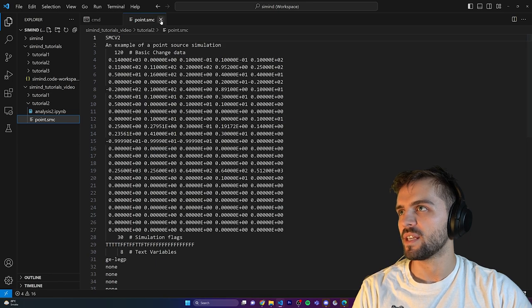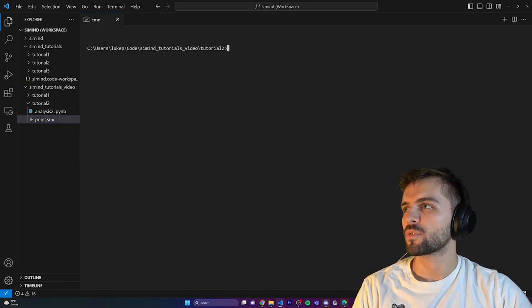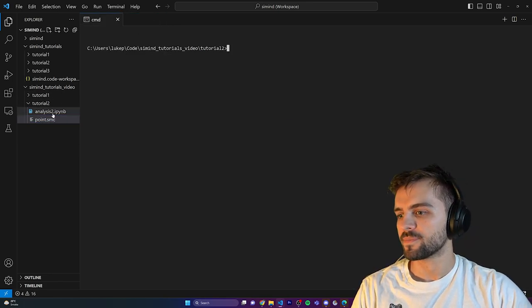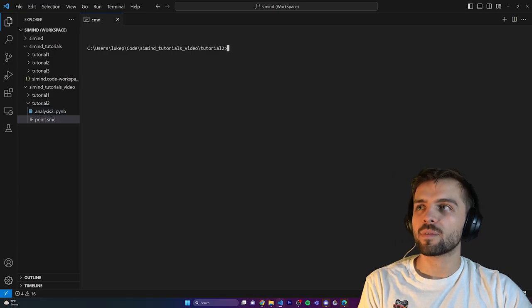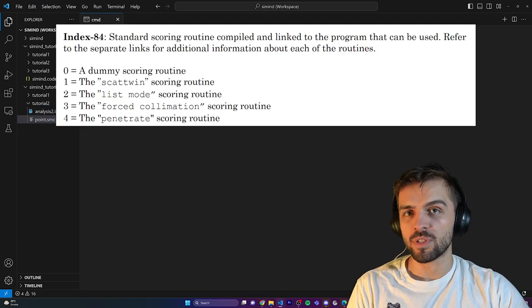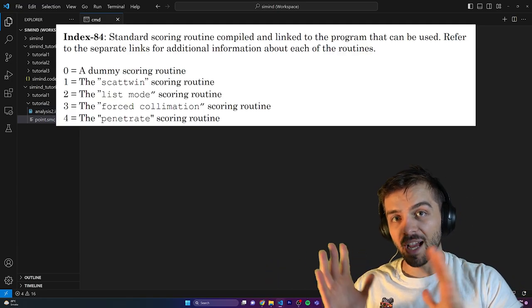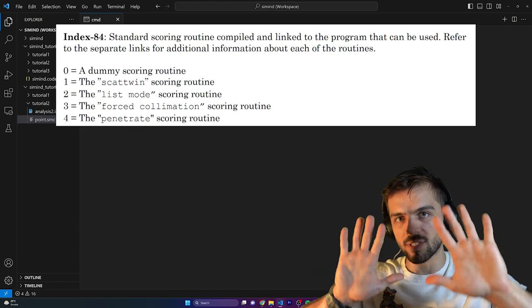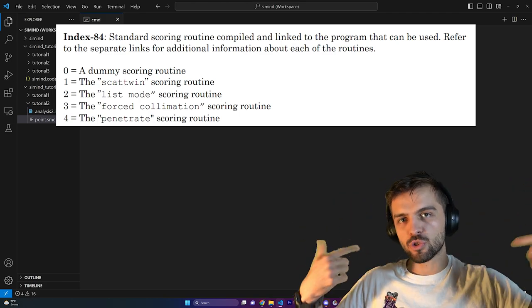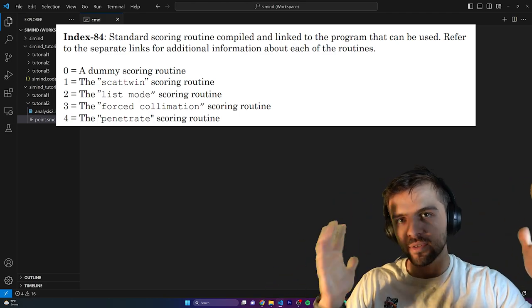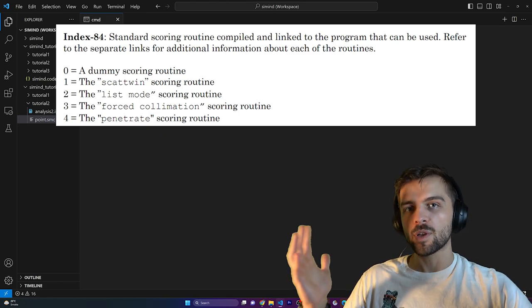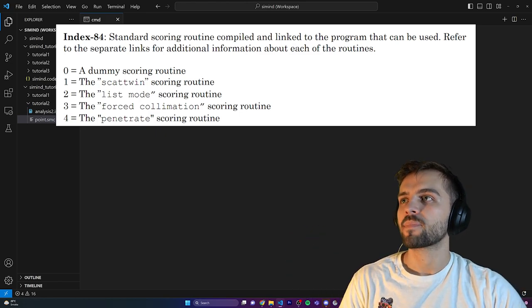Now we're going to look at a different routine. Last time we looked at the scatter window routine, which gives SPECT projections you can directly open and examine — representative of a real SPECT scan. Today we're going to look at the list mode routine.